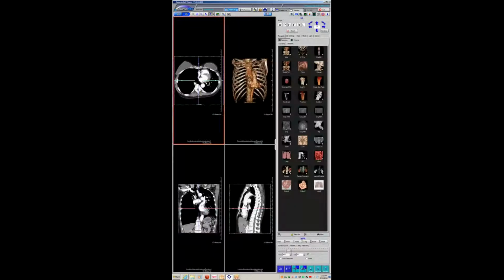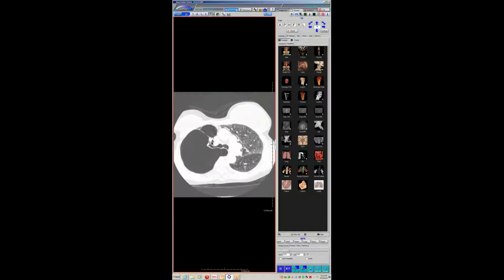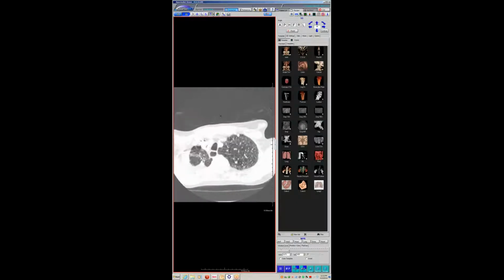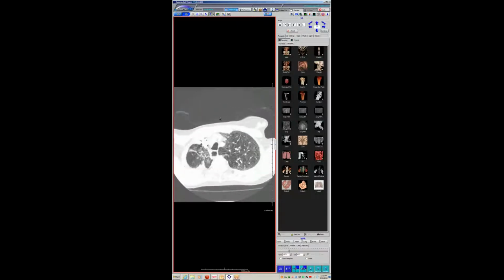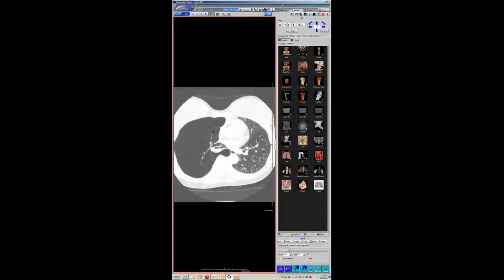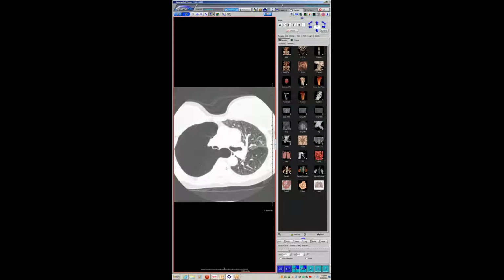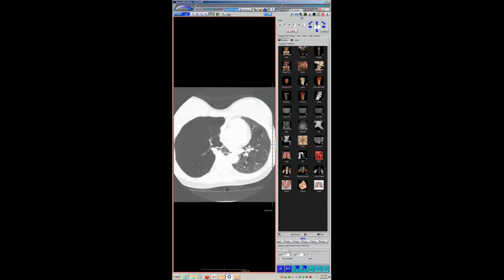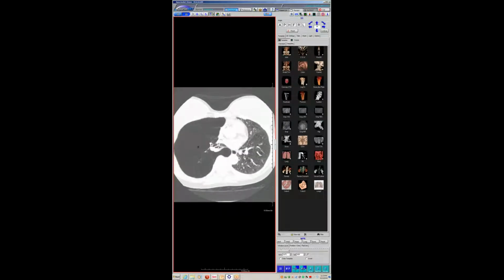So this is a patient who is a smoker, but has this, and this has been there forever. And she's young, in her 40s. No doubt she's a heavy smoker. But this is all the right middle lobe, massively hyperinflated. So here's the right lower lobe down here, here's the right upper lobe up here, and then there's just this massive thing that's all right middle lobe.